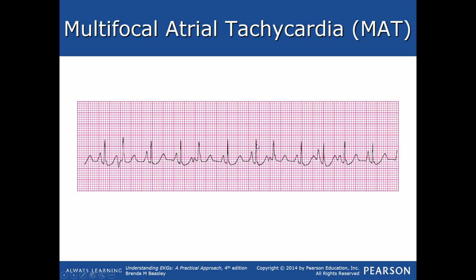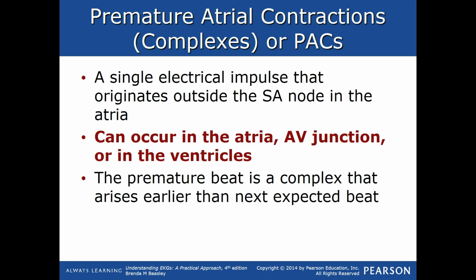So multifocal atrial tachycardia. We move into our PACs, premature atrial contractions or complexes, depending upon how you want to say it. When I was in school, and since then, I was taught to say contraction. So that's probably what you'll hear me say, although the point of this, as we'll get into, is the contraction is actually a mechanical word, and the complex is more of the electrical word, and that's what we're looking for, the electrical representation of what's going on.